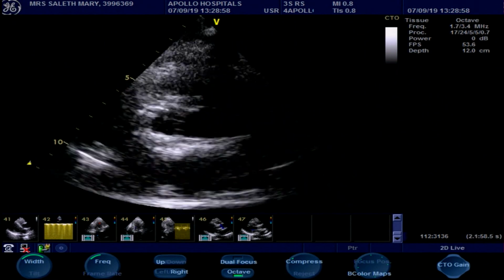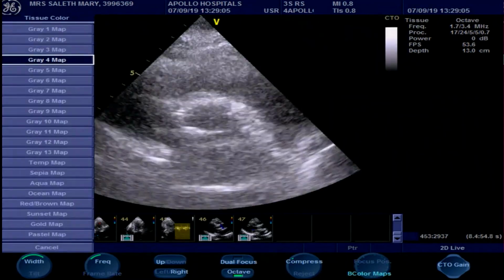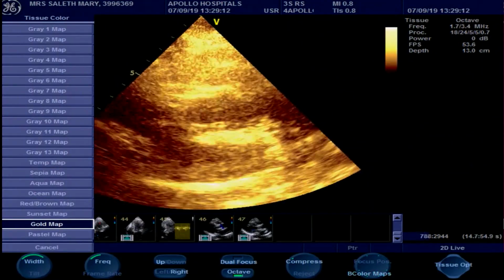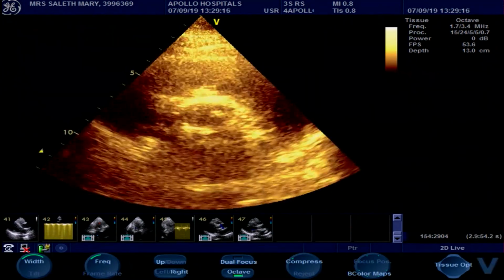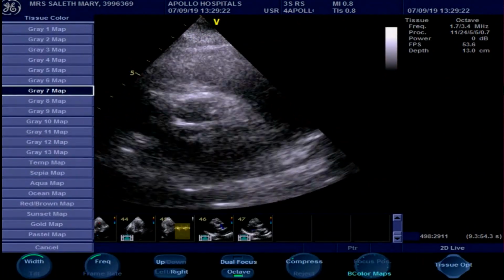So Thierry, there's no aortic regurgitation now on color Doppler. We did a quick hemodynamic study. We're quite keen to take the sheath out now, but there is no peak-to-peak gradient across the aortic valve at all. And the diastolic pressure was low, with no hemodynamic indicators of significant AR. Great. We're now showing it in short axis here.